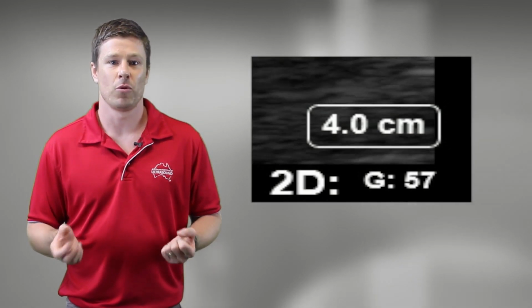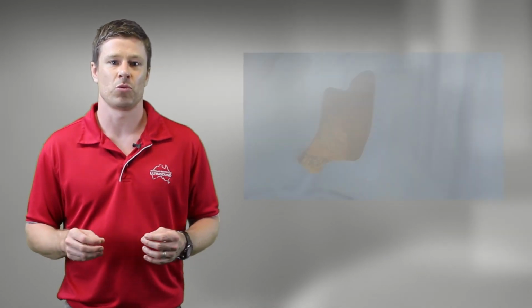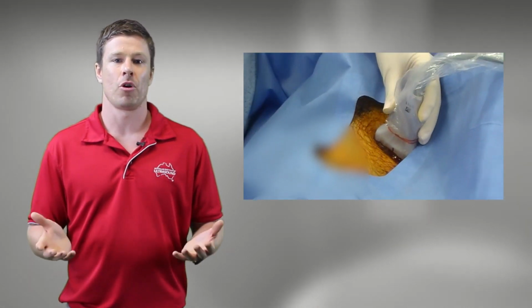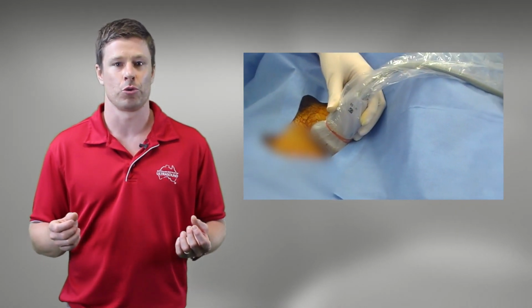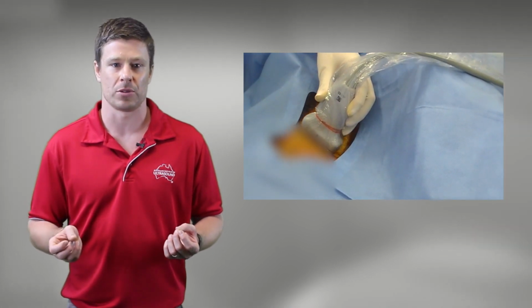Set the scan depth to 4 cm for the average sized patient. Remembering that the sartorius muscle runs from the ASIS to the medial aspect of the knee, place the probe on the mid-thigh region, roughly where you imagine the sartorius should run. This is roughly between the adductor muscles and the quadriceps muscles.